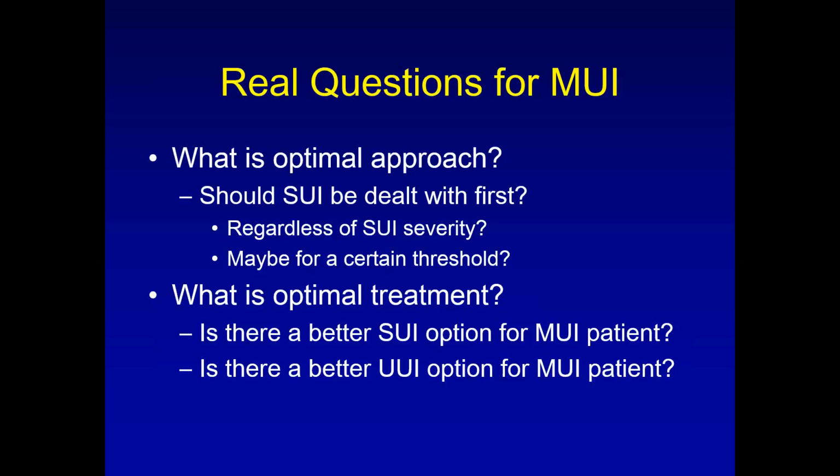Is there an optimal treatment? Can urodynamics help to align that for you? No, not really, other than we've seen other times where urodynamics evaluations showed possible voiding dysfunction problems. They may do better with a TOT type sling.